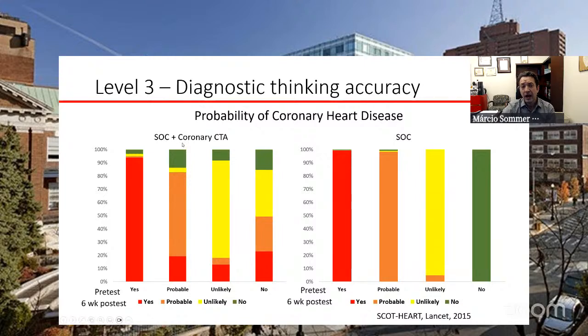So it's really more reassuring in both directions when you have both anatomical and some form of stress testing. But still, this is how much CT added compared to the one that had the treadmill only on the other side. So I think this is enough to say, well, from a diagnostic perspective, it does add, and people do see the disease differently once they get the CT results.